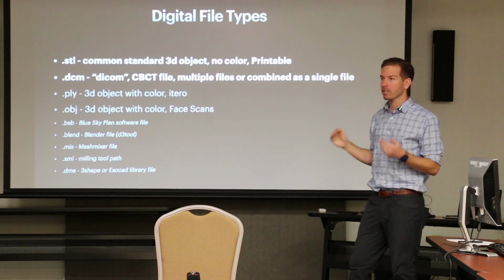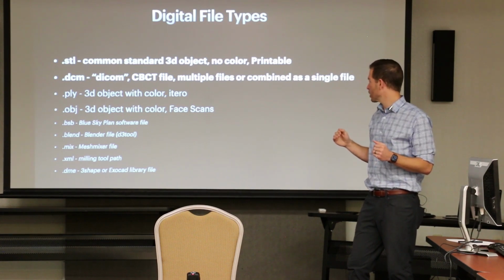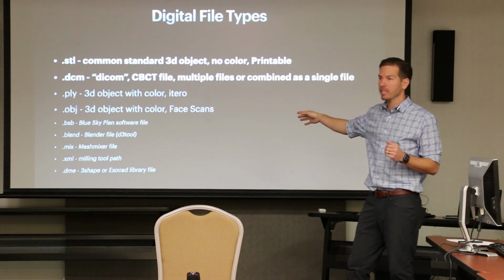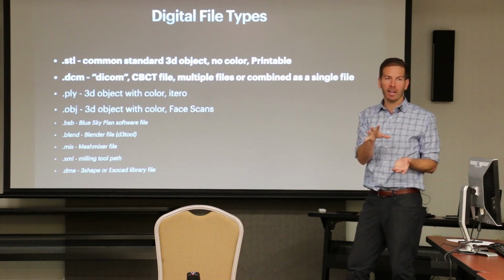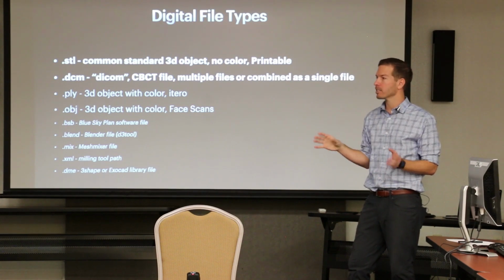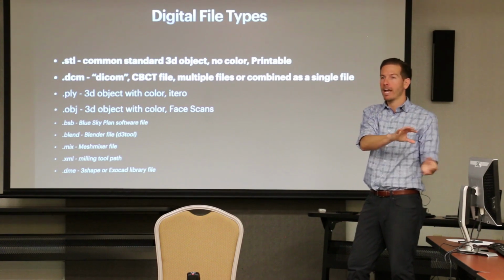This is where sometimes people get confused. Let's say your D3 tool, for splints, and you say, I saved the .blend file and it won't drop into Rayware. Well, you don't want to drop the Blender file, the D3 tool file. That's the specific file to open it back up in Blender. You want to export it as an STL.